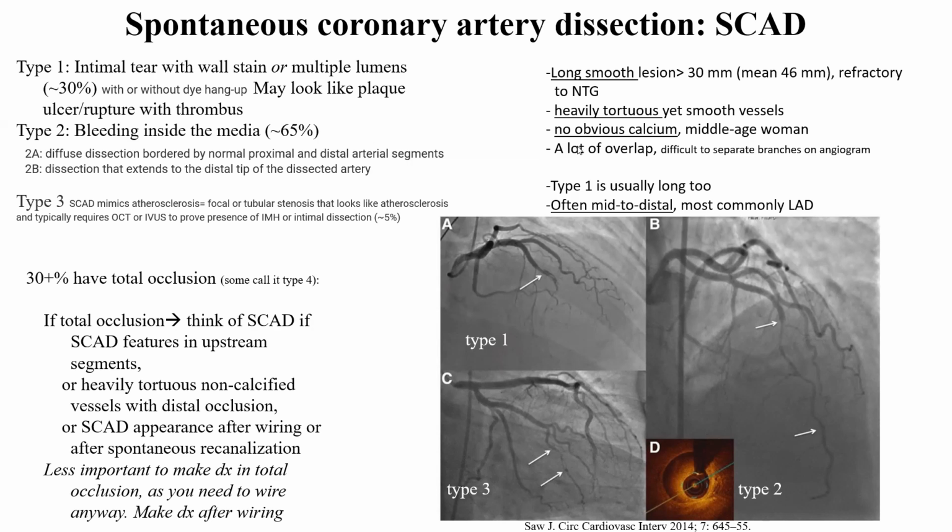Question from the audience. When it is a total occlusion, does it really matter to make a SCAD diagnosis since we have to wire it anyway?